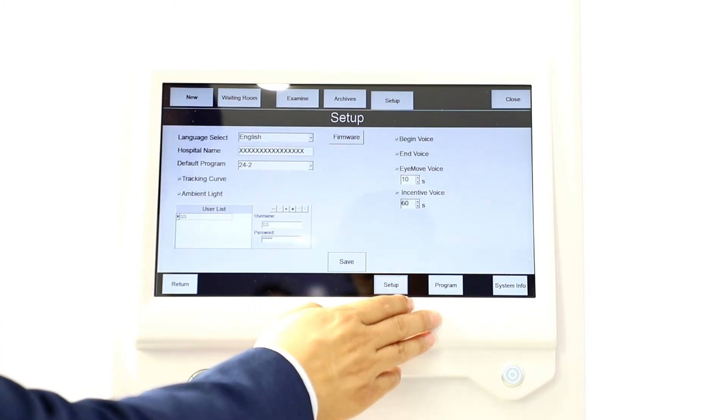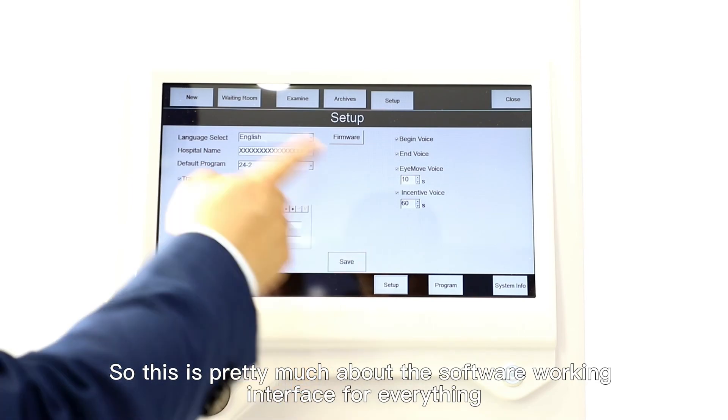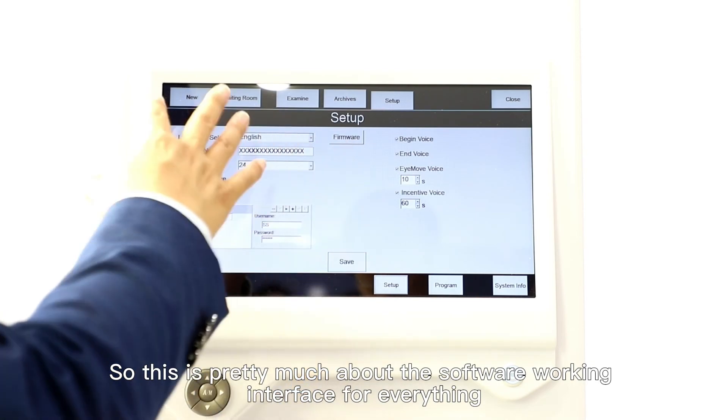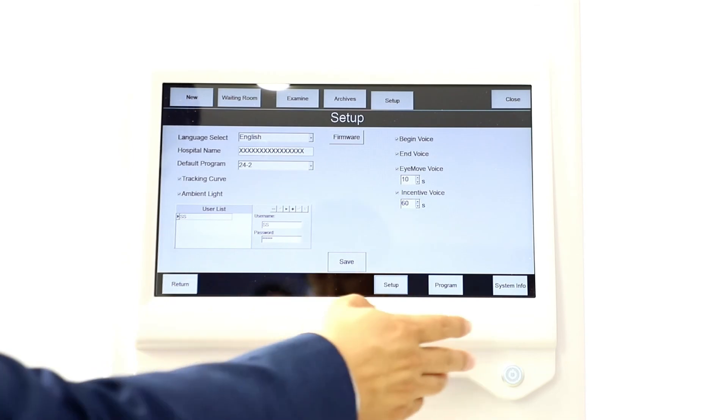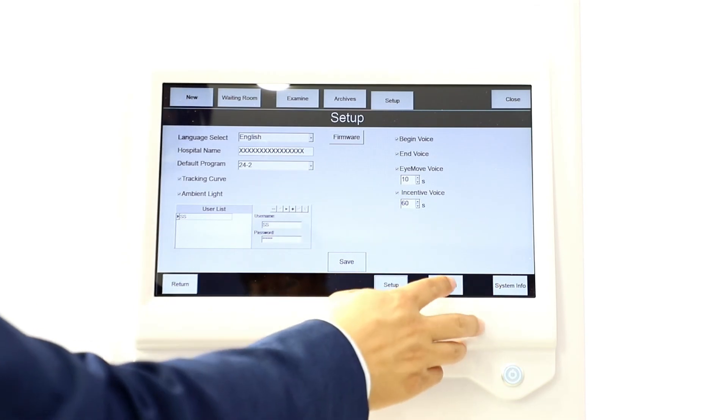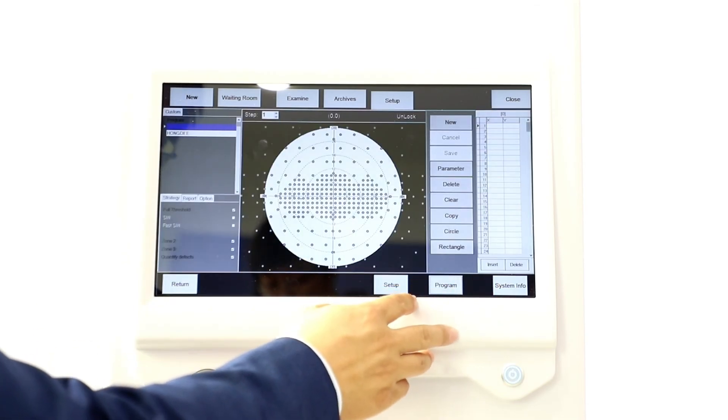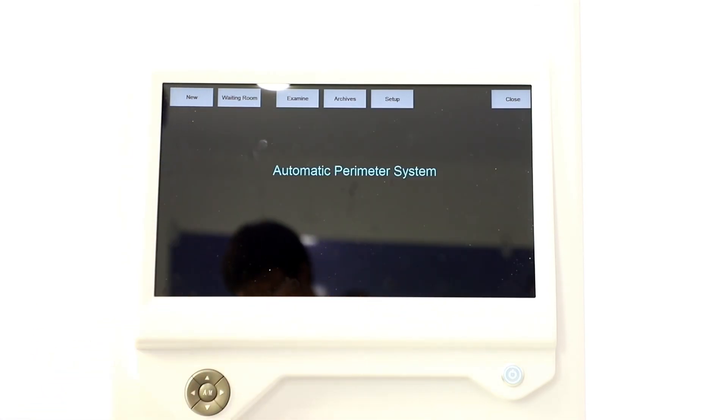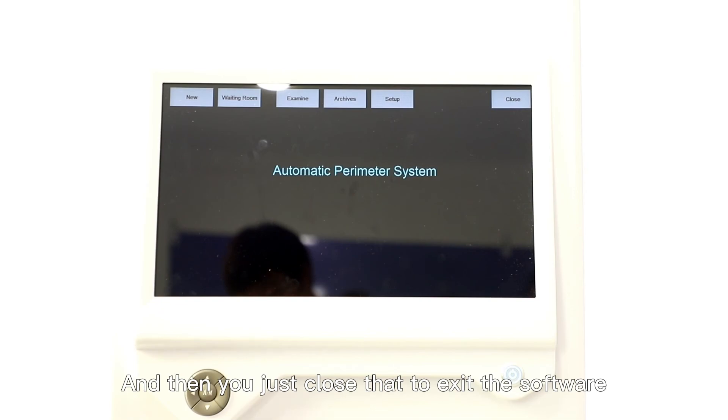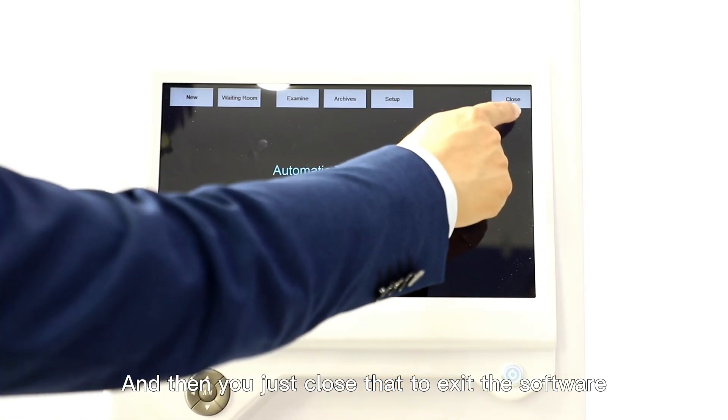This is pretty much about the software working interface for everything. Then you just close that to exit the software.